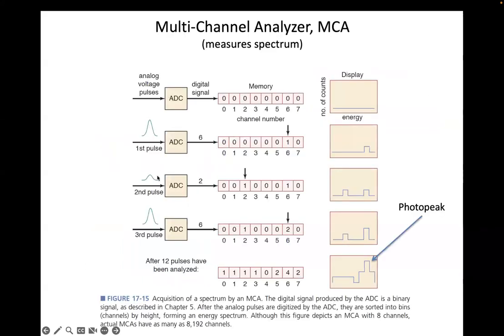So here we have these pulses coming in at a fairly good clip, right? Because the number of photons that are produced per second by the contrast agent you put into the patient can be pretty high. And so a lot of these pulses are coming through.